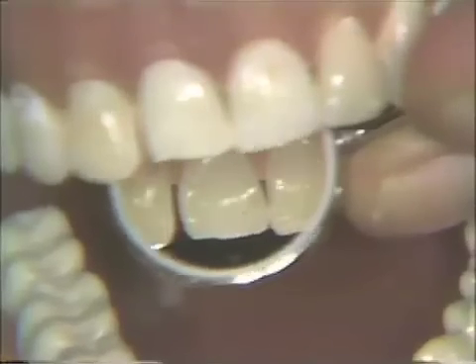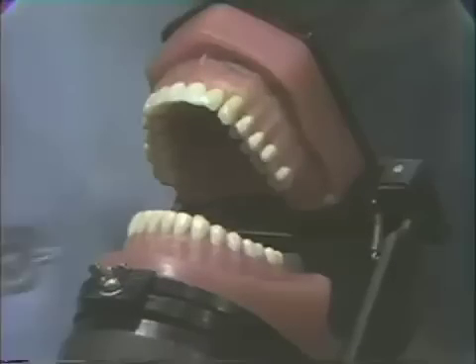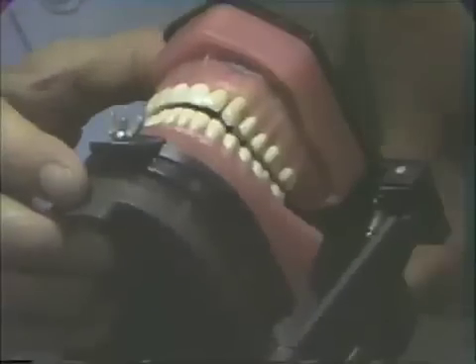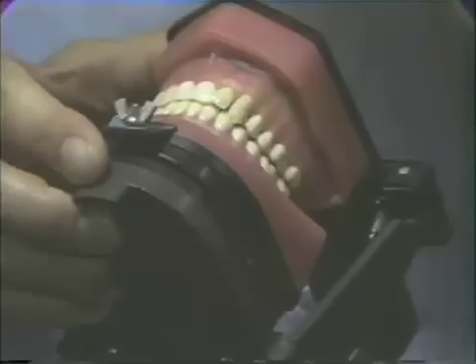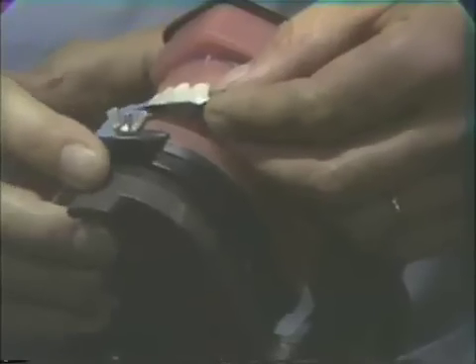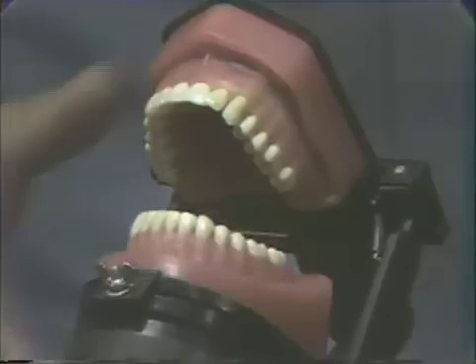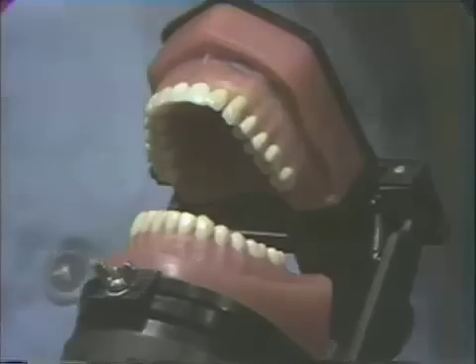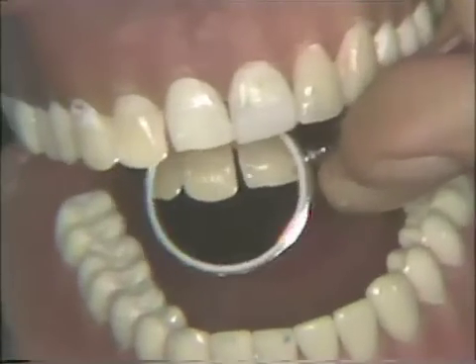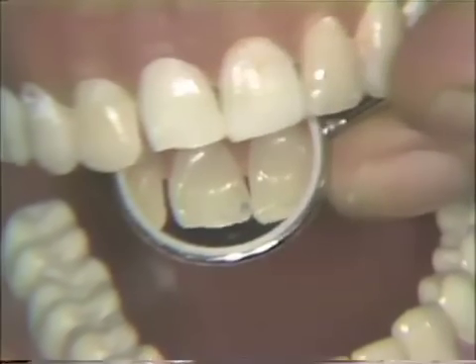Then we will check occlusion on this case. The occlusion is very important to us, of course, in any restoration. We'll first of all check it without any articulating paper and observe where the teeth strike. Then with articulating paper, have the patient close their mouth several times, and then again with a mirror, we will check to see where the contact point is in relationship to the carious lesion. We see here that it is incisal to our lesion.